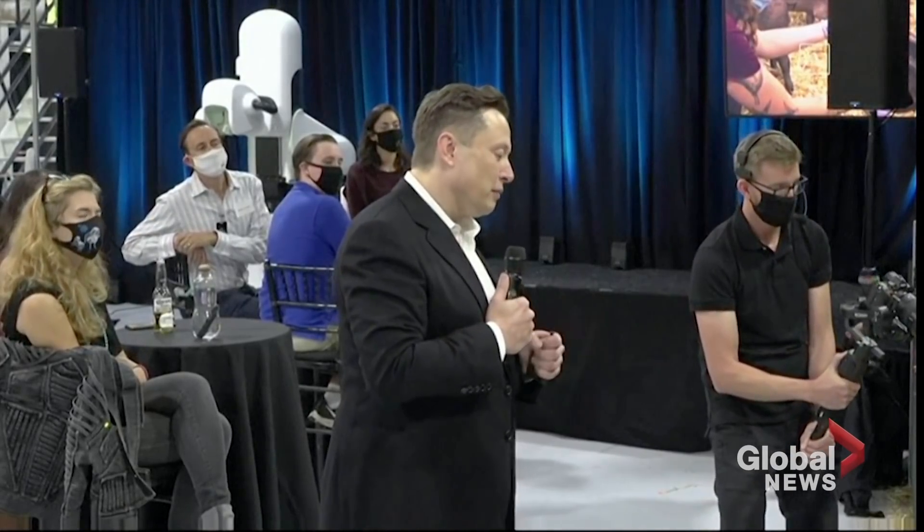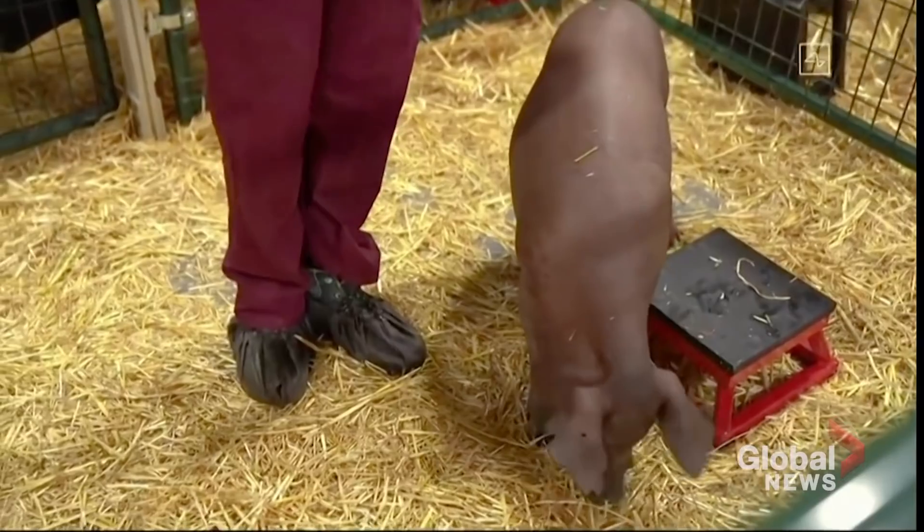So this is a healthy and happy pig with an implant that is two months old and working well.